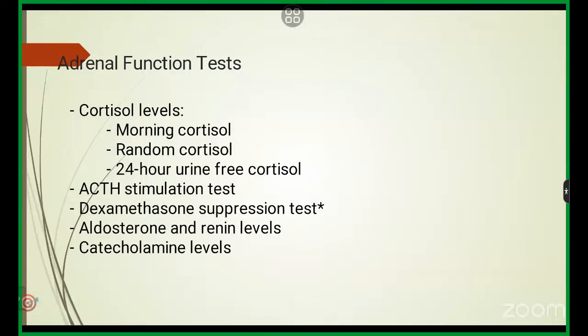So in cortisols, we have morning cortisols. When you are running cortisols, the test requested has to be specified. If not specified, you can make an inquiry from the ordering physician or clinician. If you are unable to reach the physician, it's good to consider finding an amicable way of understanding what is being requested. You can look at the clinical history. You can try to look for information concerning the tests that have been requested, but don't just draw the sample and run the test.